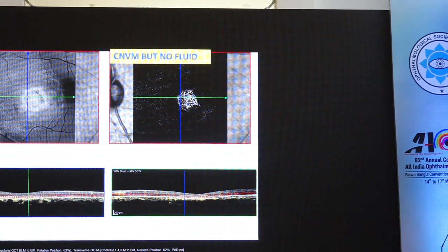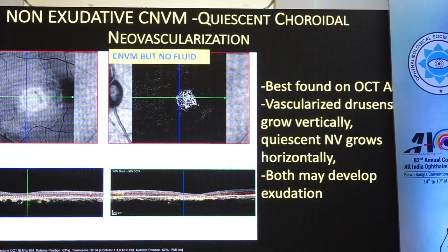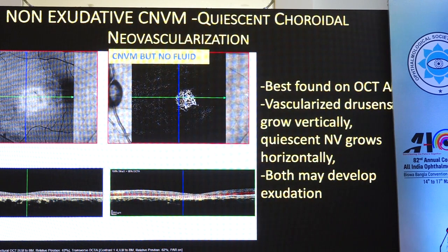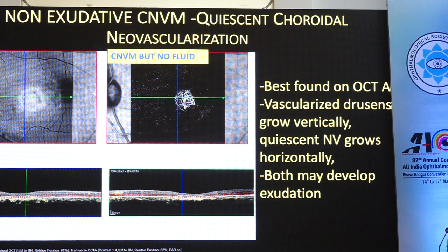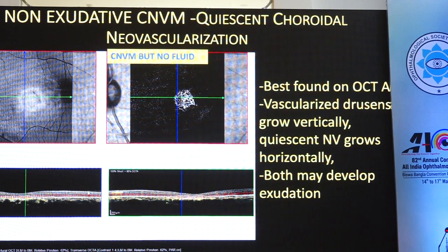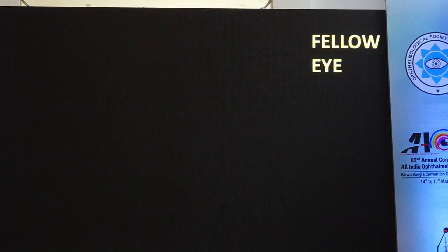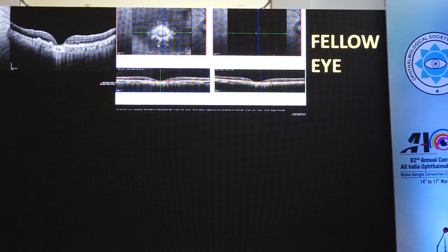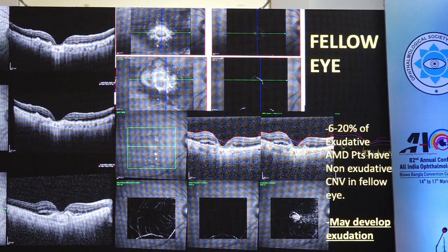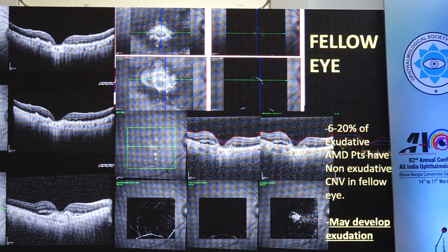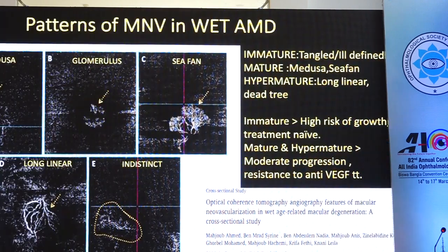This is another similar situation where the CNV is present but there is no fluid — this is a quiescent choroidal neovascularization. They are also best found on OCT angiography. The difference between vascularized drusen and the quiescent lesion is that one grows vertically and the other grows horizontally, but both may develop exudation at a later date. The fellow eye of patients who have exudative macular degeneration should be carefully looked at — about 6 to 20 percent of exudative AMD patients have non-exudative choroidal neovascular membrane in the other eye.